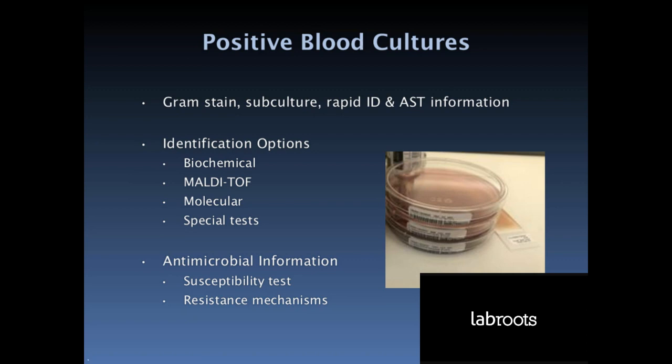If direct identifications from the blood culture are not possible, there will be a delay until colonies from the subcultures are available to test, and then a further delay for however long the identification test takes.